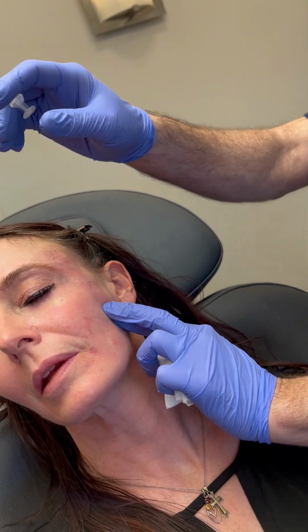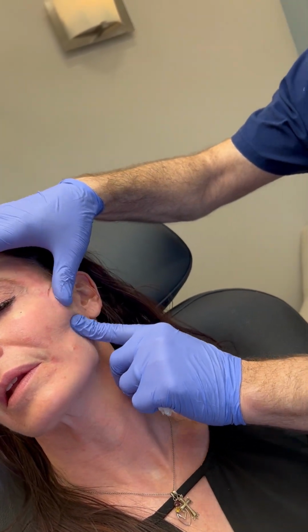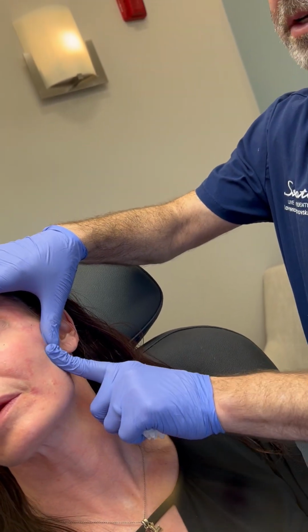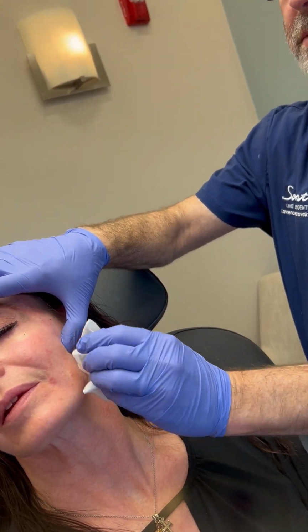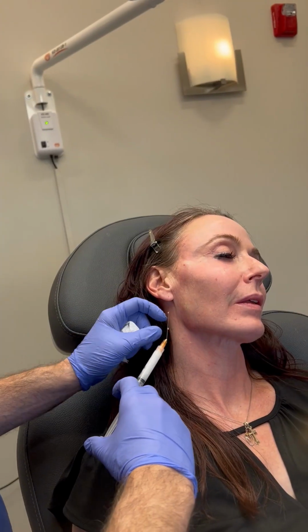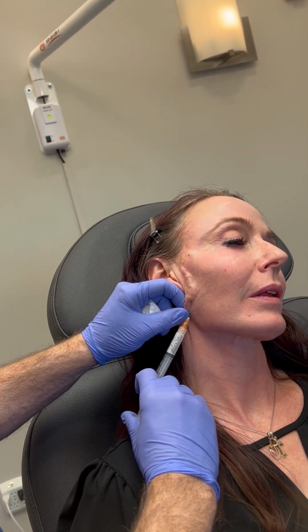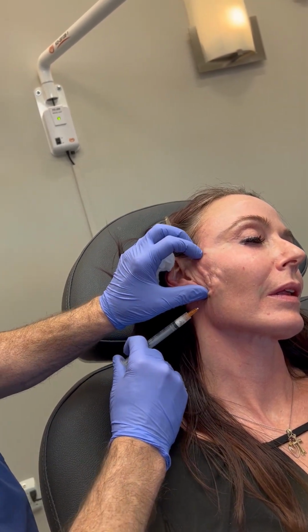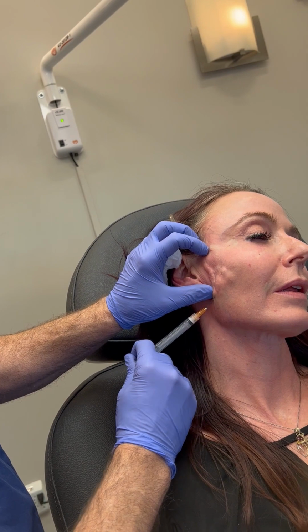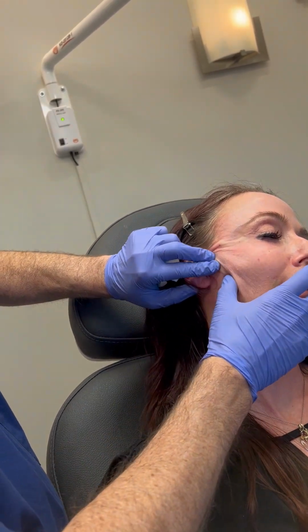So we did our preauricular area. Again, we're staying superficial. The parotid gland is under there. We don't want to be deep. We want to be just under the skin. And that was 2.5 cc's there, and we can adjust it up or down depending on how hollow the area is. I'm hydrodissecting forward here in a push ahead technique. And again, that's the preauricular 2.5.